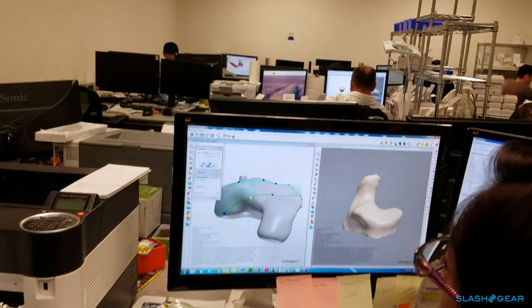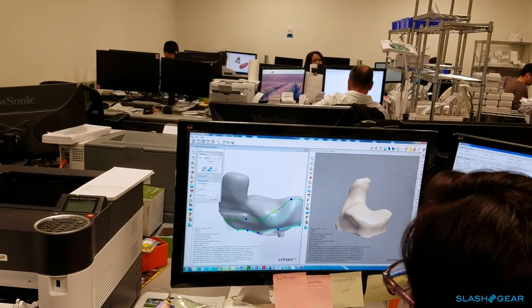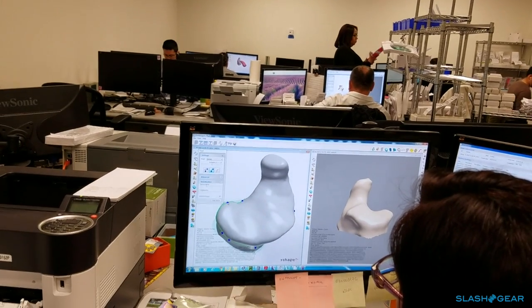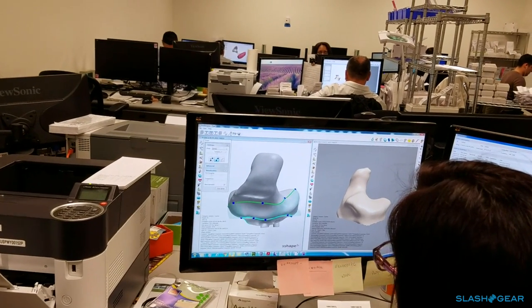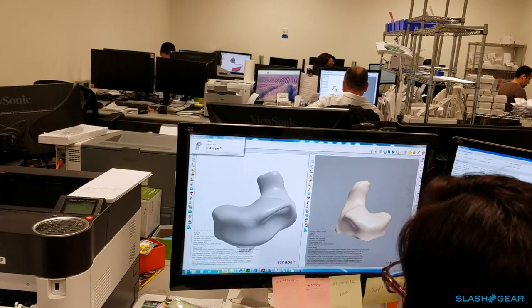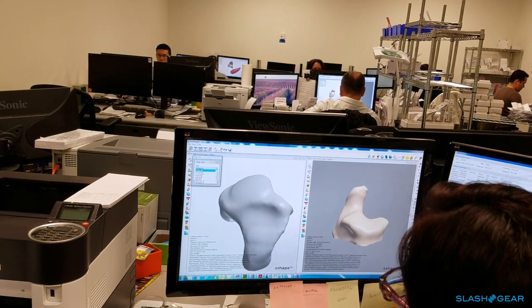This is a full shell, and I'm trimming all the extra material around the faceplate. By doing that, she knows what should fit comfortably in the ear — she's taking any sharp edges away so that it's comfortable when it's addressing the patient's ear.